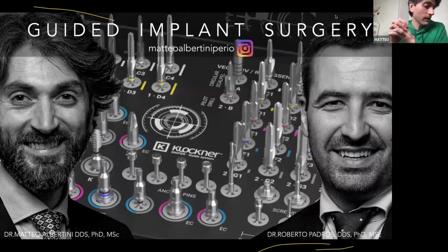In this webinar, I have explained what I had prepared to you to go and use this system in a conscious way. Okay, and when you start using the system, you will understand all these small tips I give to you.